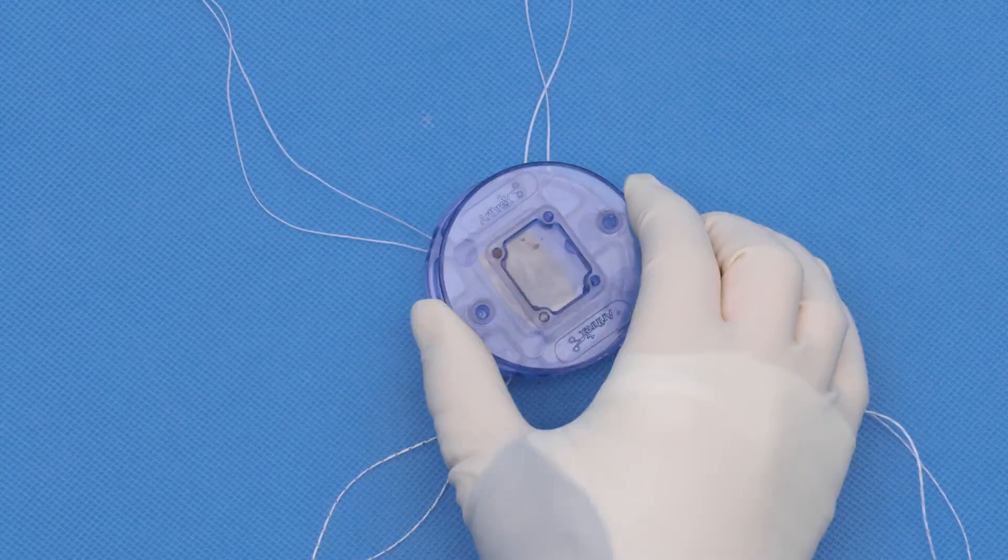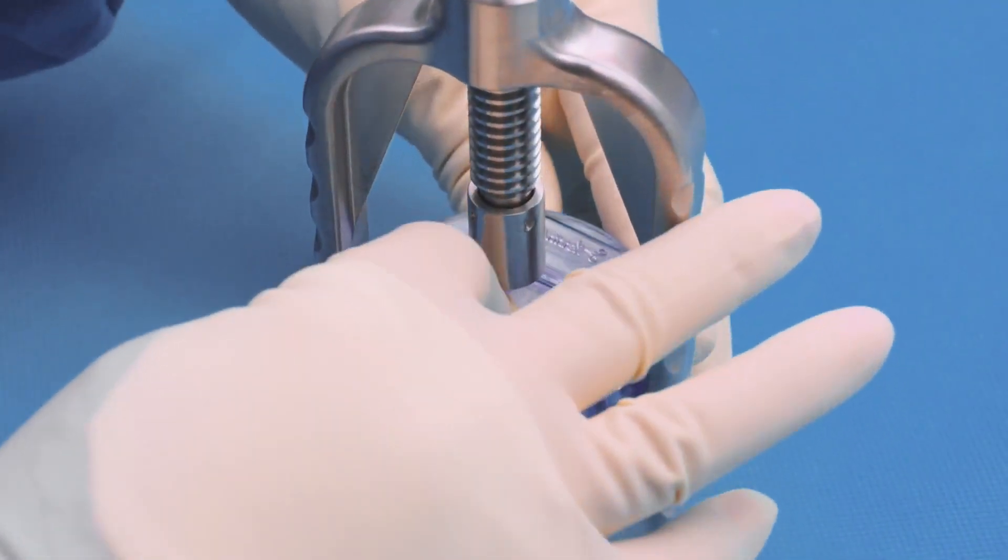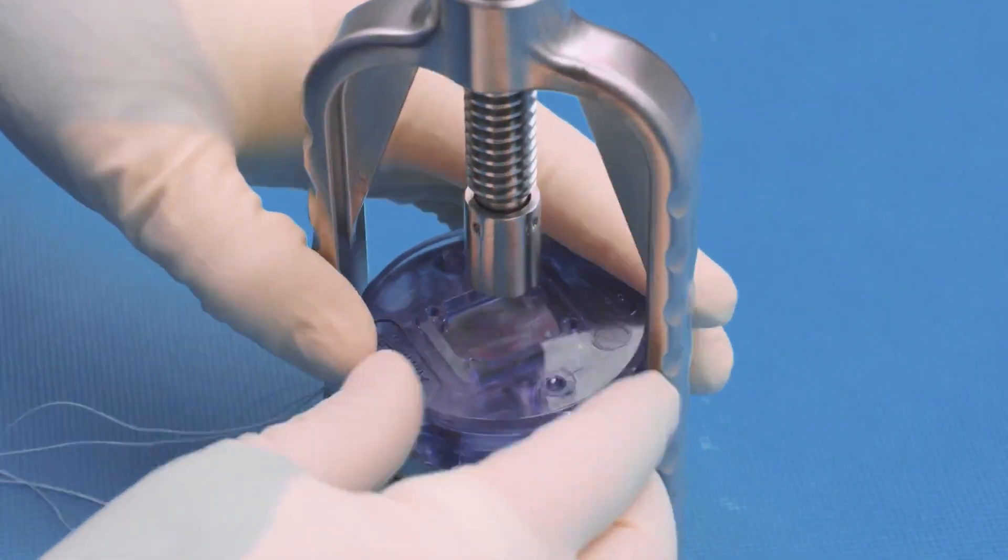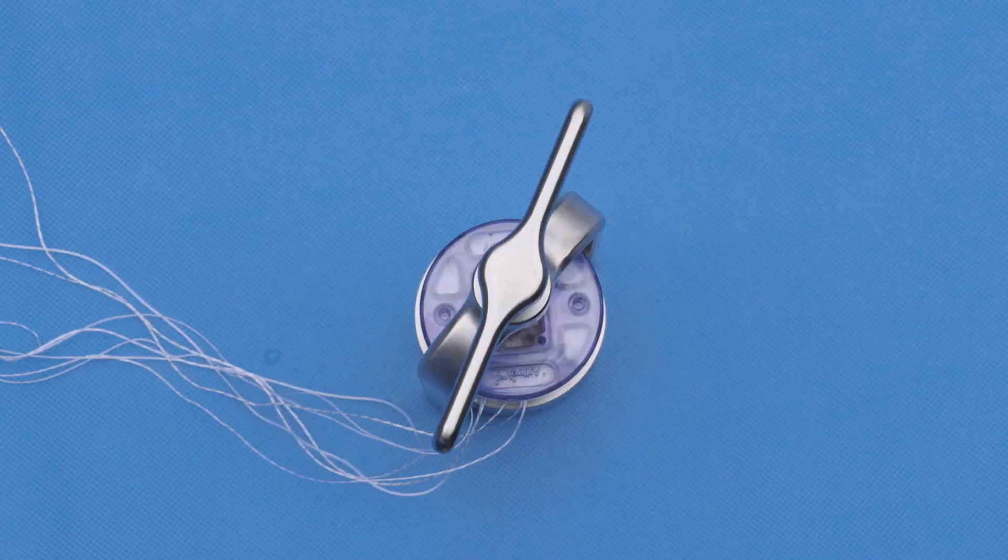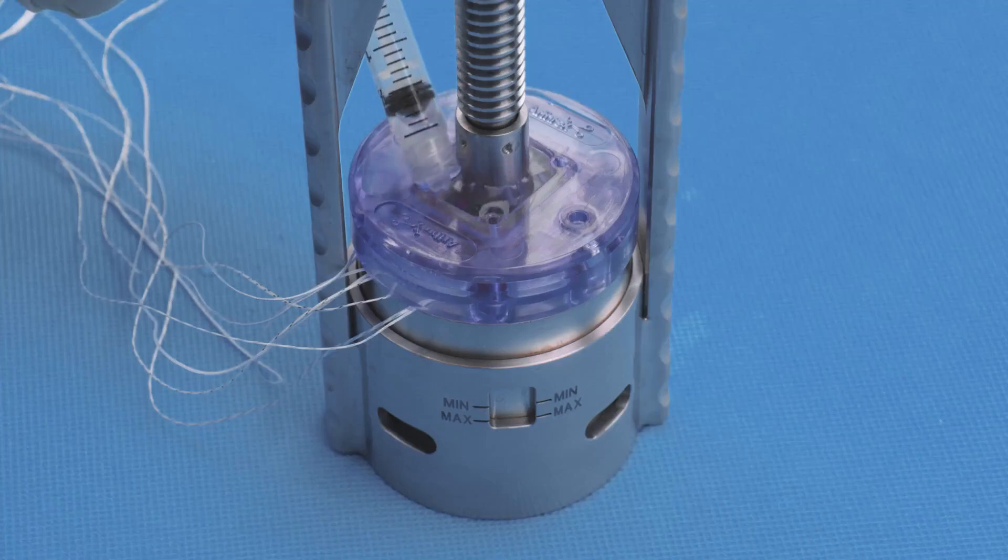If the surgeon is not yet ready for the graft, it is recommended to place the graft in the plates and place under some compression to help keep the graft shape. Additionally, some saline can be added to keep the graft hydrated.